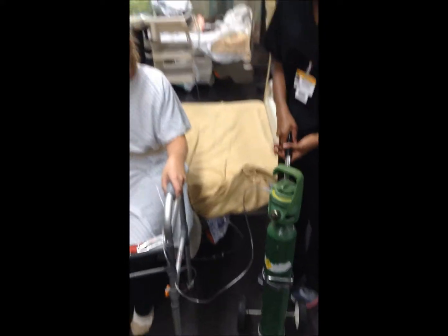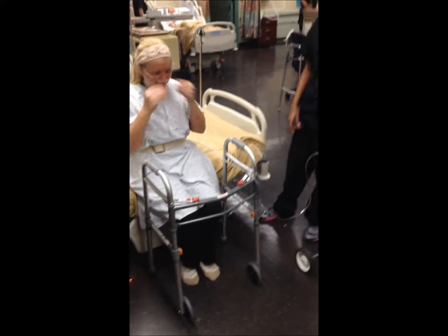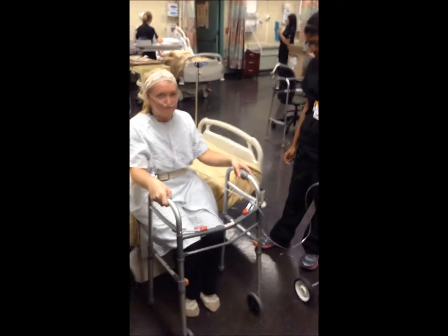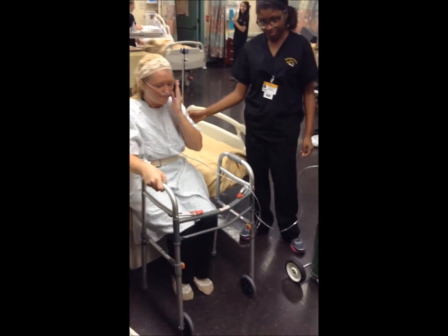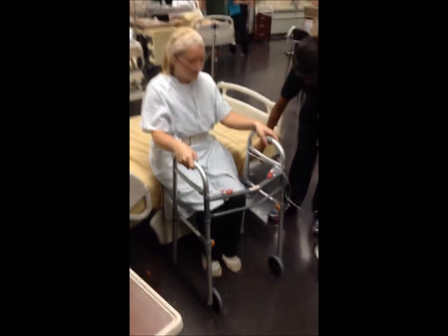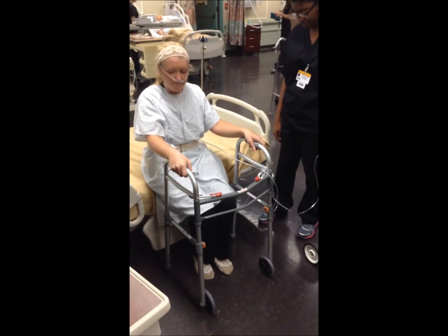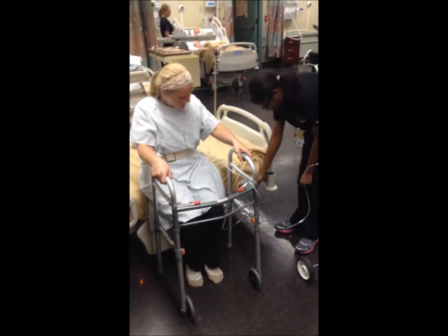Another important rule is to make sure the bed is in the low position and that it's locked so that it doesn't move while the patient gets out of bed. And another rule is to always have your dominant hand on the patient while transferring and then a non-dominant hand on the tether. Our patient has a saline lock on her IV, so she doesn't have that tether, so her only tethers are a Foley catheter and oxygen.